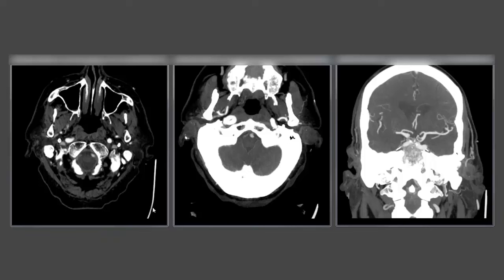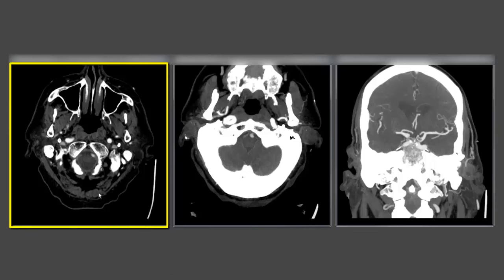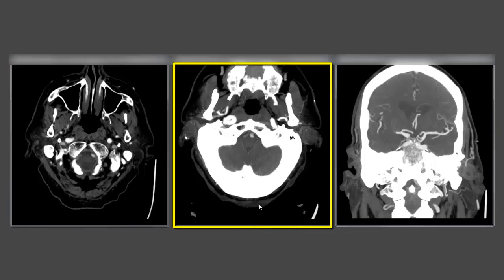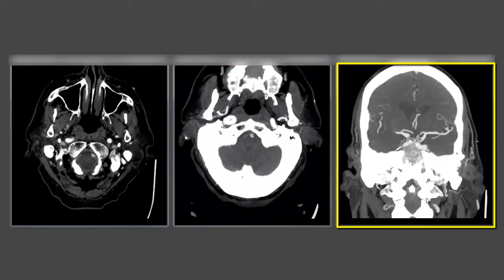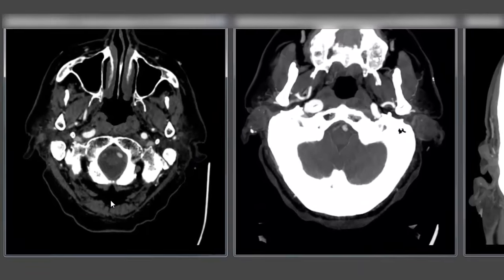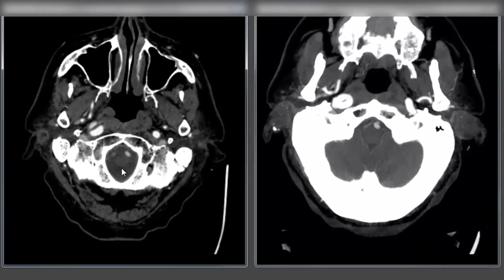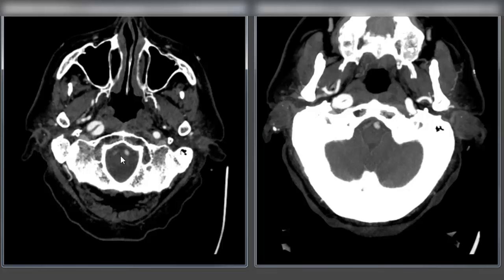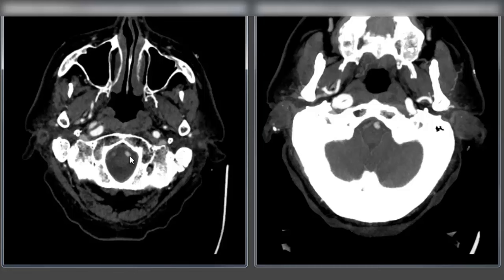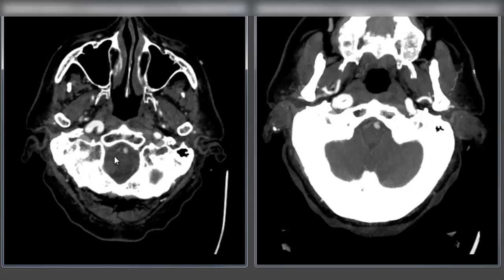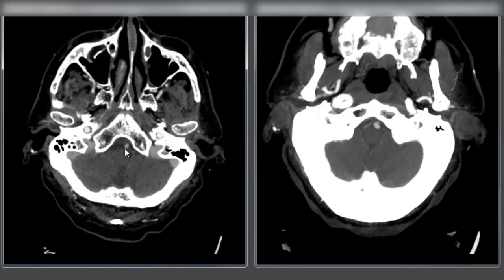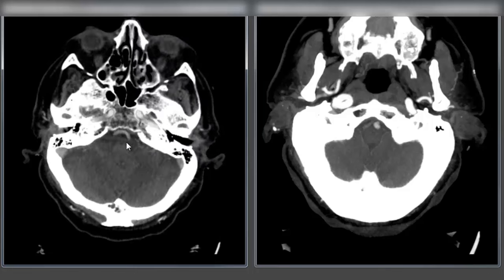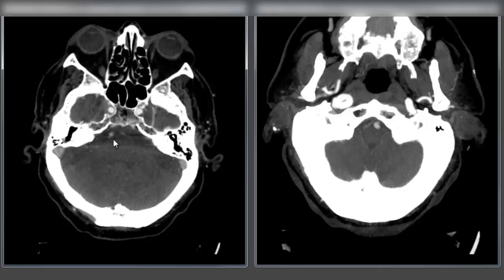On the CT angiogram here we have our source images, our axial thick MIPs, and our coronal thick MIPs. Looking at the source images first, we see coming up from the skull base both vertebral arteries — a more dominant left vert, as is the common pattern, and a diminutive right vert — and the two come together at the vertebro-basilar junction. Here's the basilar coming up.